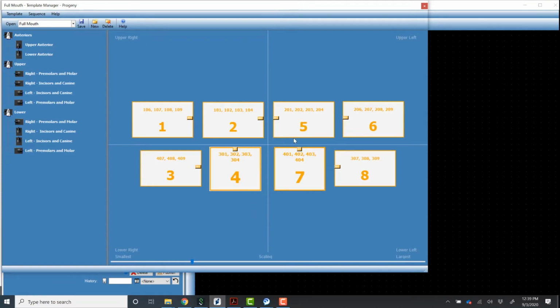And then we're going to flip our patient, and we can acquire these just as they are here. So we just had to change the order on the one side, and the rest are really matching up. So then we go up here to hit save, and now this is saved. So now we have modified this existing template so that we can take our images in lateral recumbency. So it's very easy. Now, maybe we want 10 images for our patient in lateral recumbency.